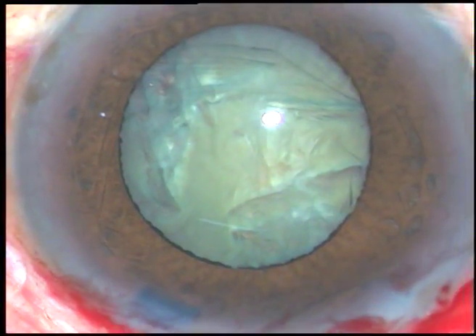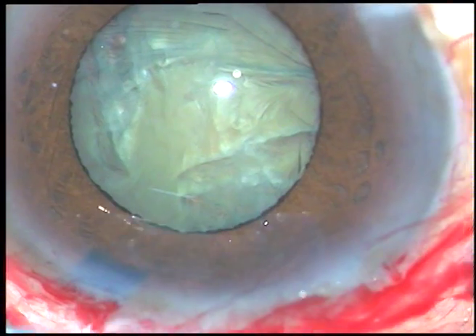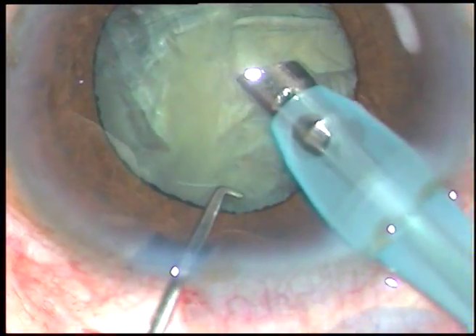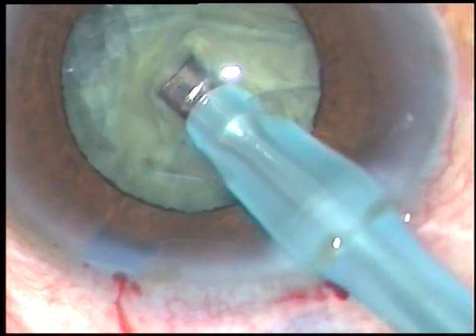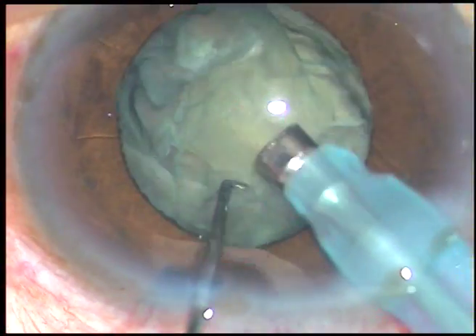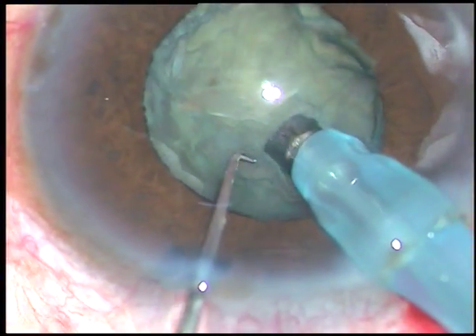The machine I am using is the Oertly phaco machine, Oertly Cataracts 3. And here goes the tip. Now, a little bit of superficial cortical matter is removed, and then the tip is buried into the substance of the nucleus.